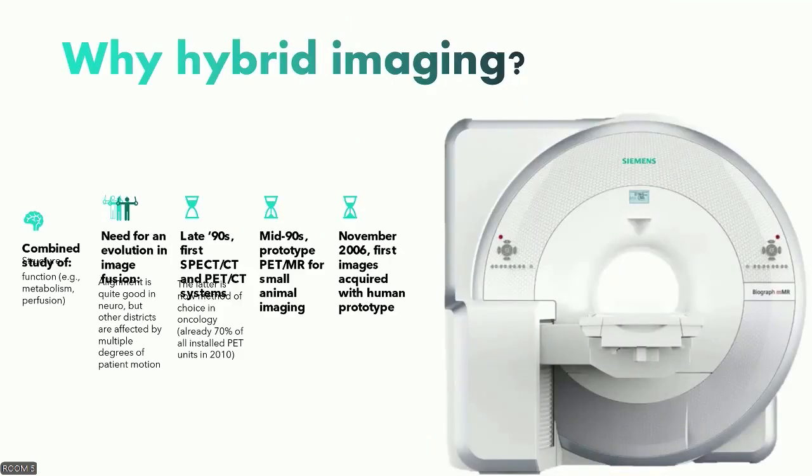So why hybrid imaging? It doesn't really display correctly. Anyway, of course, because we can simultaneously study multiple properties of the district of interest, and especially for districts other than neuro, hybrid imaging allows for a better co-registration of the modalities. In neuro, you may as well do a nuclear medicine exam and then co-register to a structural MRI and get acceptable results. But in other districts affected by body motion, by physiological motion, this is quite harder. But we will see that PET-MR actually allows a better motion correction.